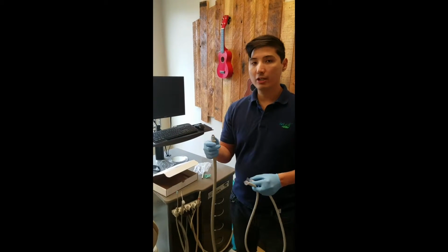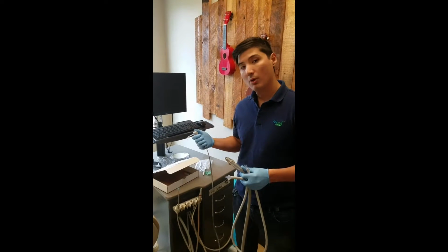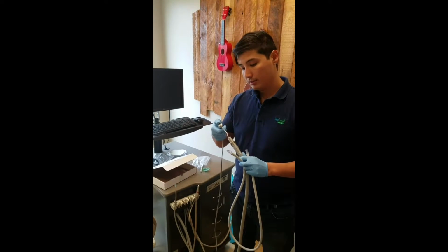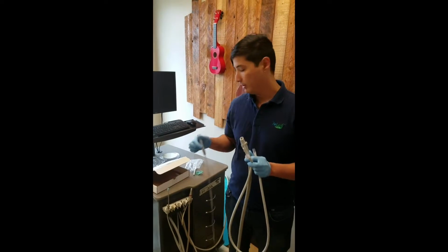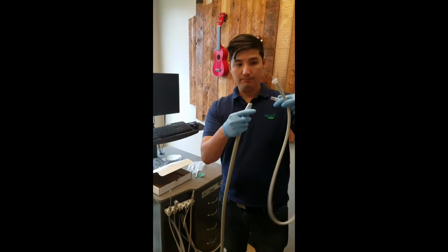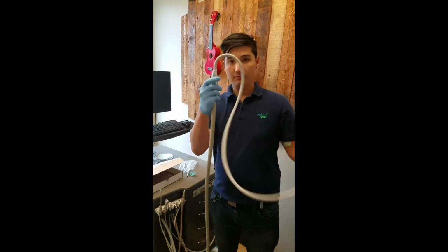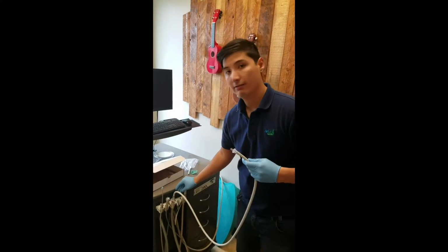If you're in a hygiene chair and you haven't used this a lot, it helps sometimes to get your air water syringe and put a little bit of water in there. It'll help lube up that gasket and allow ReLeaf to slide in there nice and easy. So it's just going to go right there, like so.